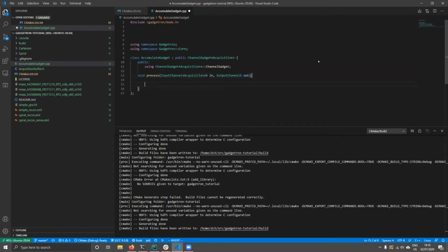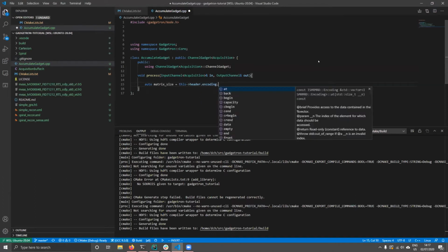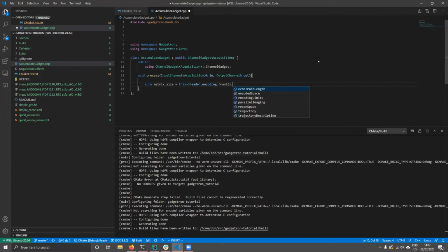Okay, so I guess what this goes to show is that you should not try to program C++ without an IDE to help you. So now we're getting a lot of nice help. So I don't have to remember what everything is called. So the header has an encoding, which contains recon space and a matrix size, which we want.